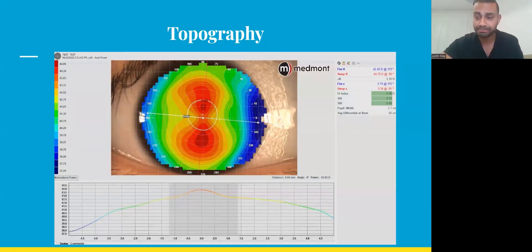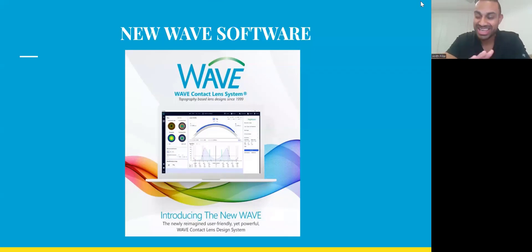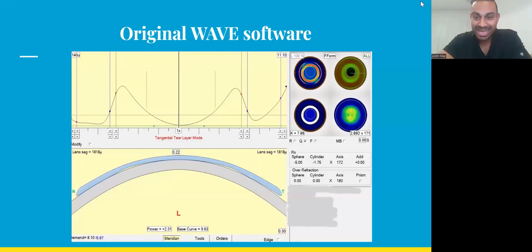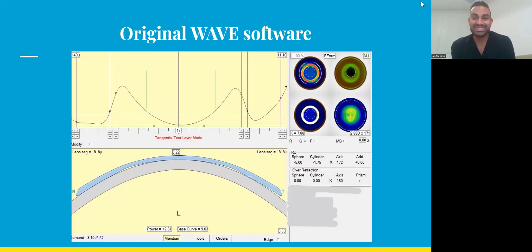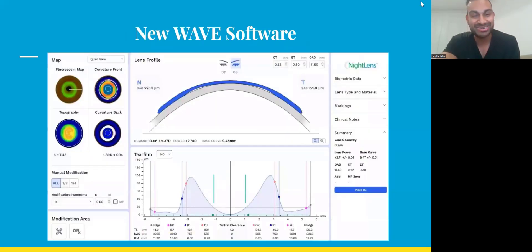Now let's talk about the new Wave software. To start, here's the original Wave software, which shows the tear film profile on top and the RGP profile below, with four images on the right showing a simulated fluorescein pattern, imported corneal topography, and anterior and posterior surfaces.